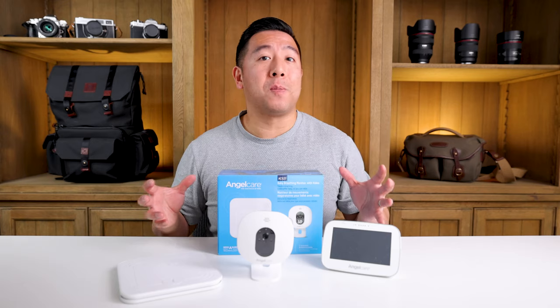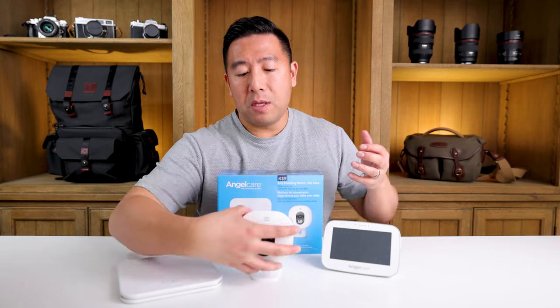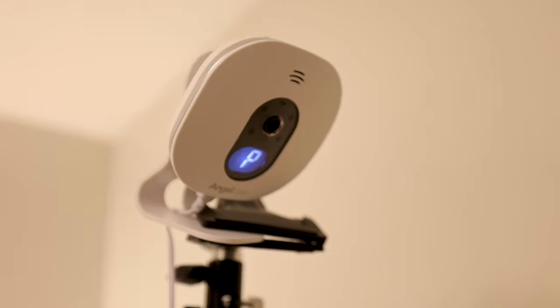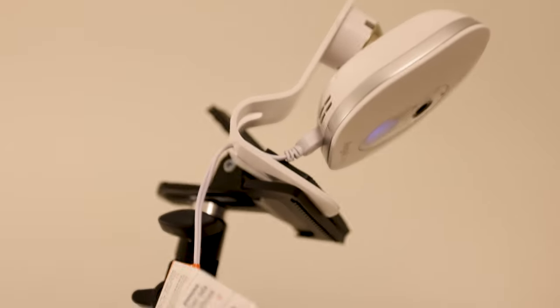The final thing that really ticks me off is how the camera mounts. Although it comes with a table stand and a magnetic latch, a table may not be the perfect height — and for me it really wasn't.